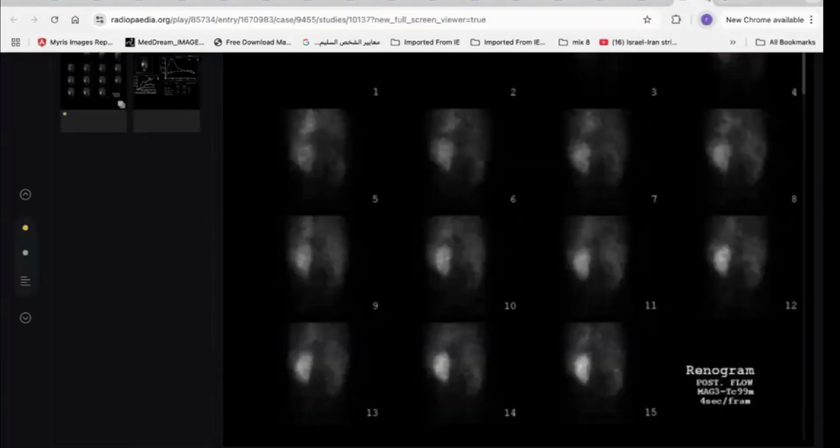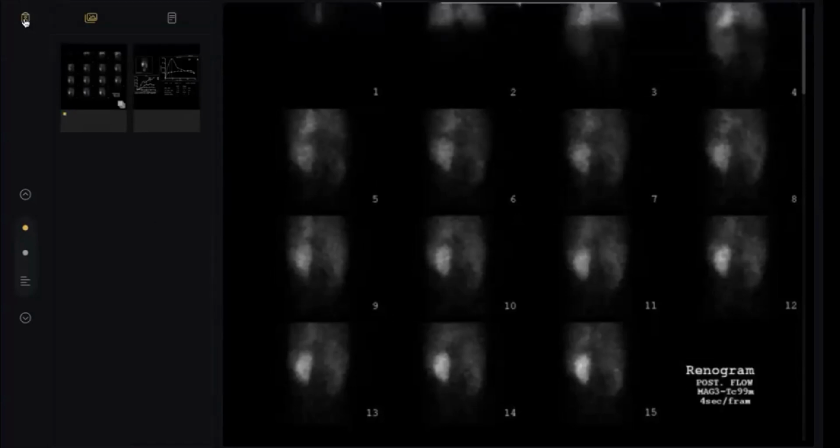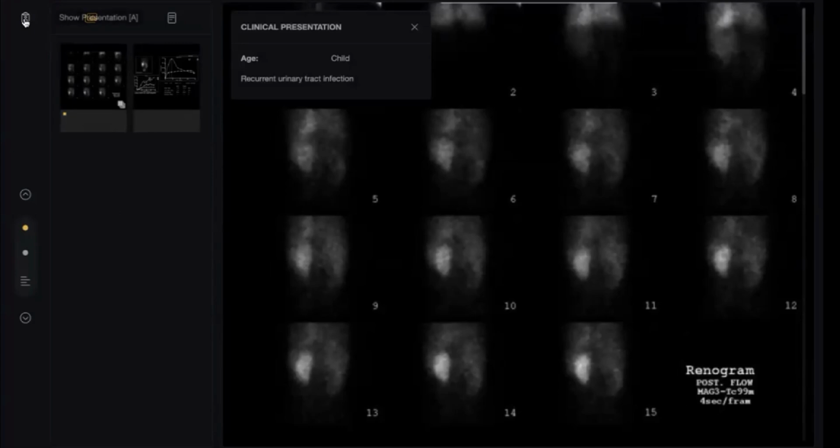Welcome. By the way, you will not be presented with a normal case at all in the exam, but I brought this case just for confirmation of my introduction.